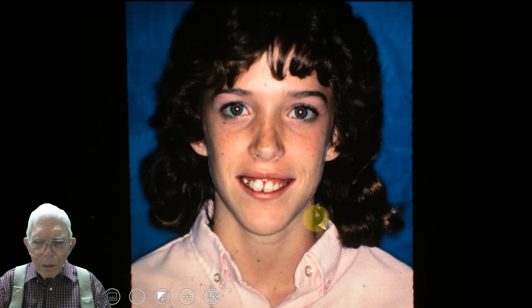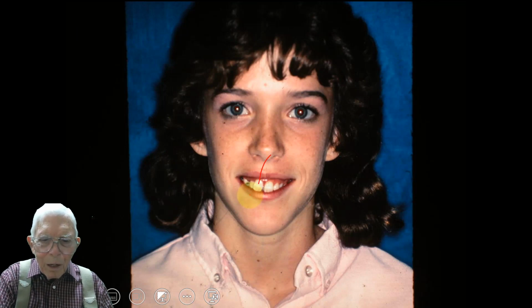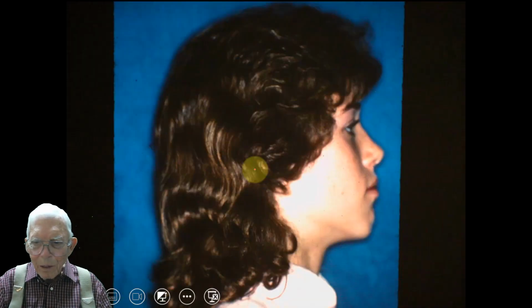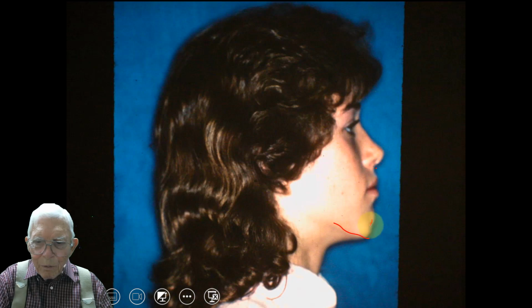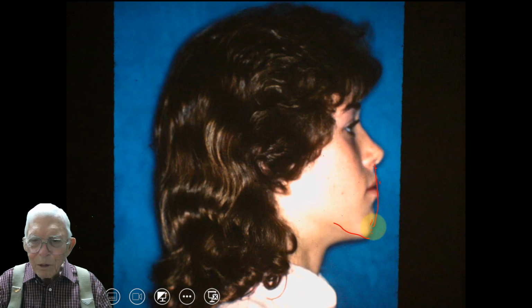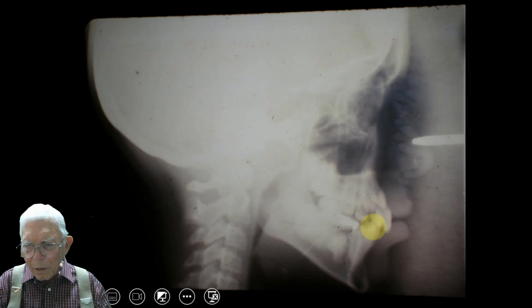You can see that central twisted off up there like that. There's a cuspid stuck up there in between that central and the lateral. Looking from this side, the profile, even though she's a mouth breather to some extent, the vertical dimension of the face looks quite well, and the profile looks quite well. We're going to have to take out some bicuspids here, and it'll still look well because we're going to go back and take out distal bicuspids.